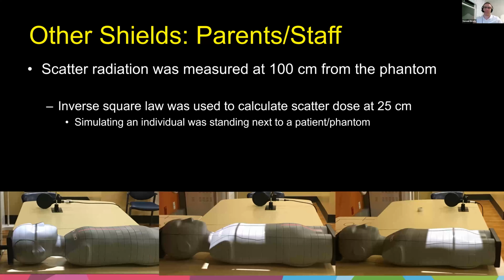I've actually done that many times. Most of the time the parent goes, really? Oh, okay. I didn't know the shielding was in the machine. Explaining collimators and lights is a very good way to explain to them why we don't need to be afraid of radiation going all over the patient.